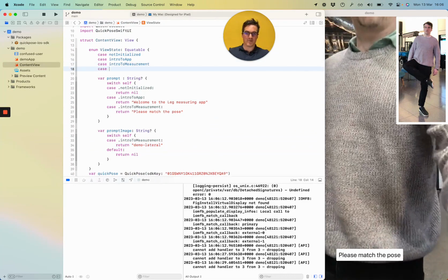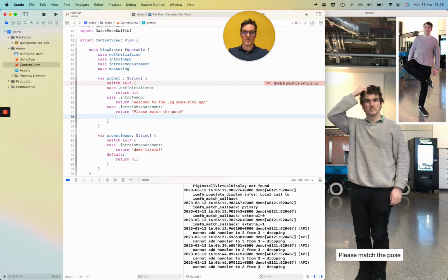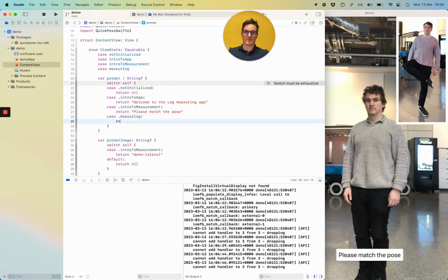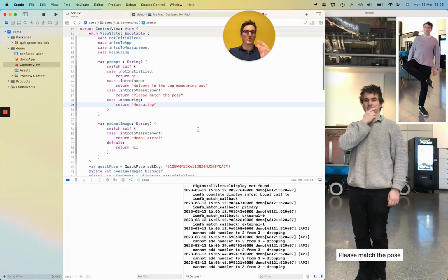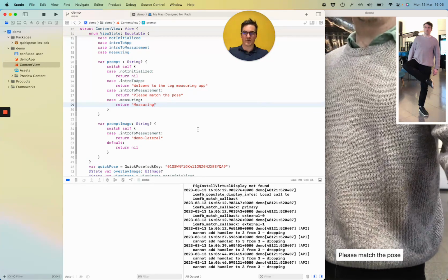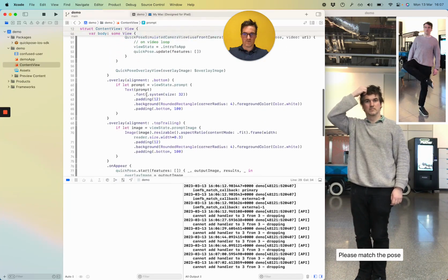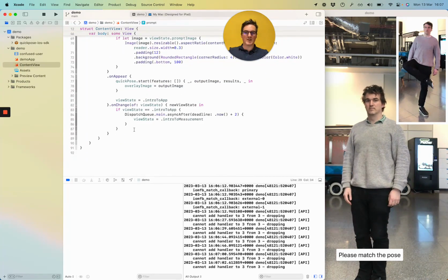So the next step is measuring. And then I'm just going to give a little text prompt to say "measuring." It's useful for people to have quite an explicit prompt like "stay still" or "we're measuring now" rather than just being caught without them realizing. Okay. So what does measuring mean?